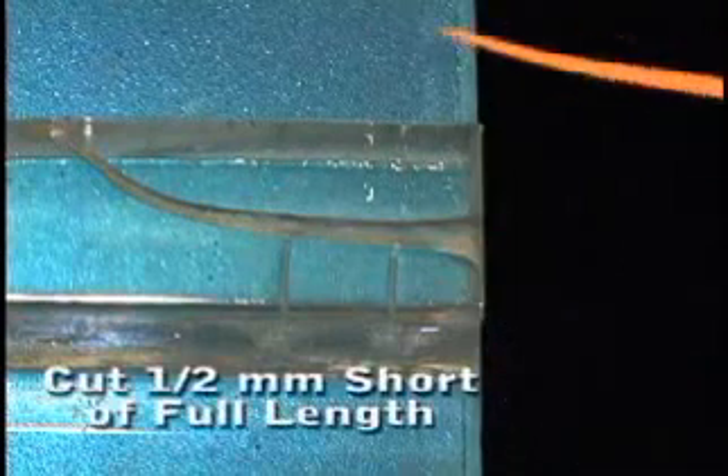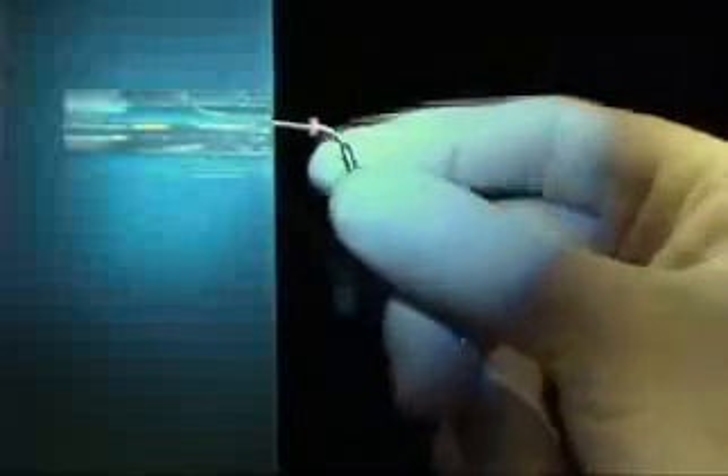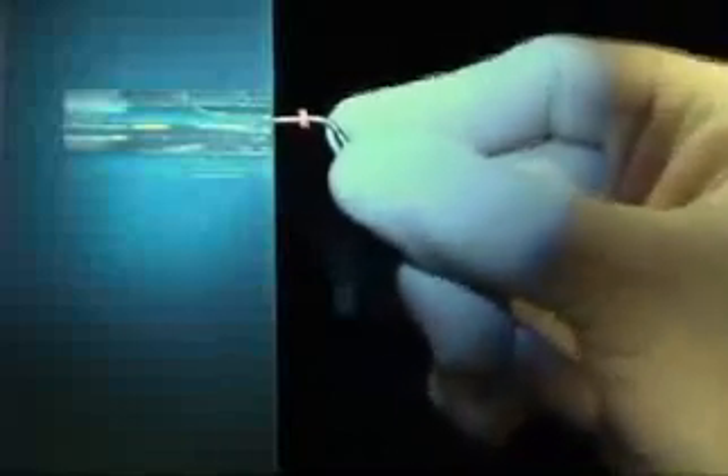A cone is fit in the prepared canal, cut back a half millimeter short of full length. A plugger of the same taper is fit in the canal, pushed and wiggled — the canal will bend the plugger to its binding point. A stop is placed so we know where that binding point is, and we're ready to cement the cone.